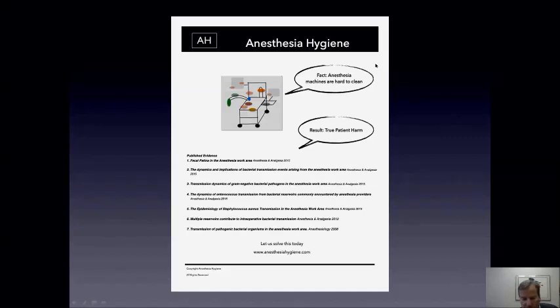So as I was just mentioning earlier, people started focusing because there was heavy contamination of the anesthesia machines, and there were also a lot of time constraints from the OR side with regards to cleaning the machine in between cases and maintaining the flow of the OR between patients. So people came up with all the laryngoscopes and alcohol canister, but really there was not much attention paid towards the anesthesia work surface.